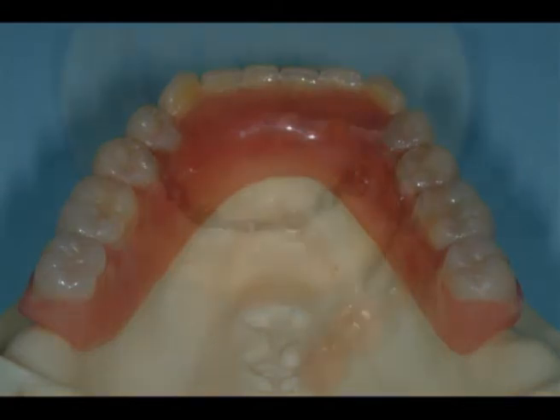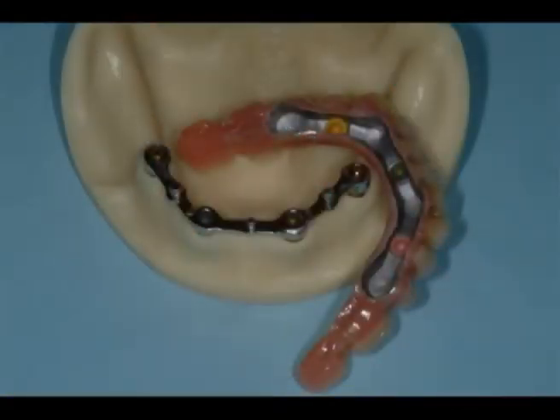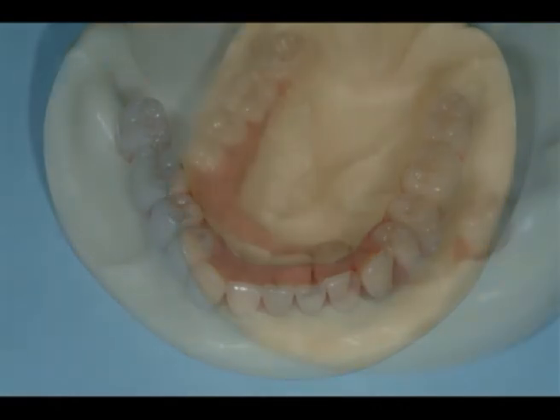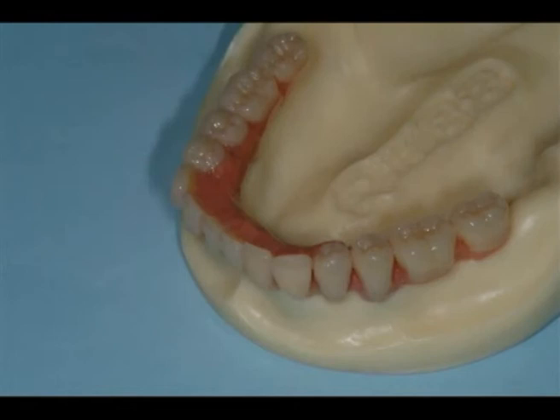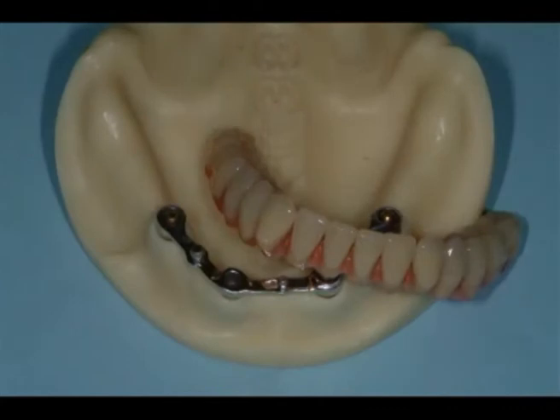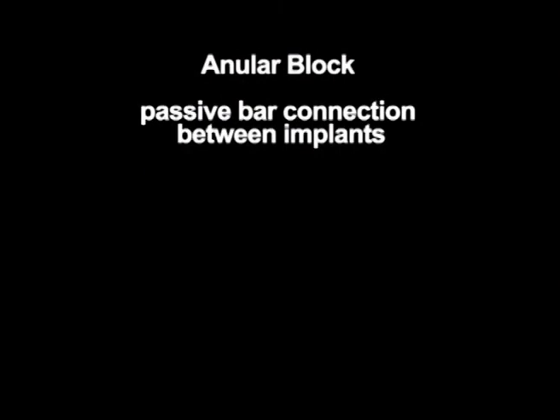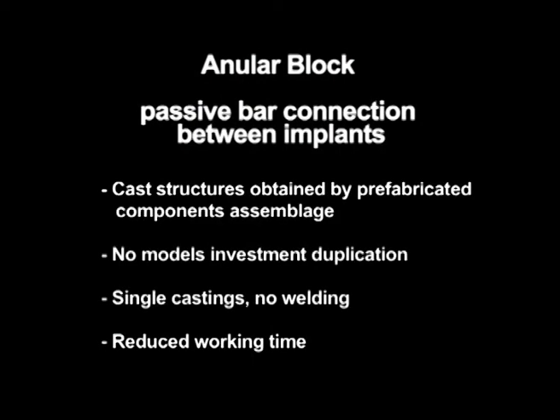The size of these dentures can be adjusted case by case. You can have a full-size denture, a reduced palatal denture, even a non-palatal and tissue denture, like a fixed implant-supported prosthesis, where shape follows only the teeth and does not lay on any tissue or palate, with lots of benefits for aesthetic, phonetic, and hygiene.